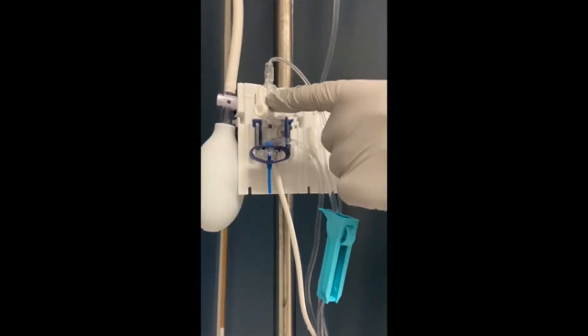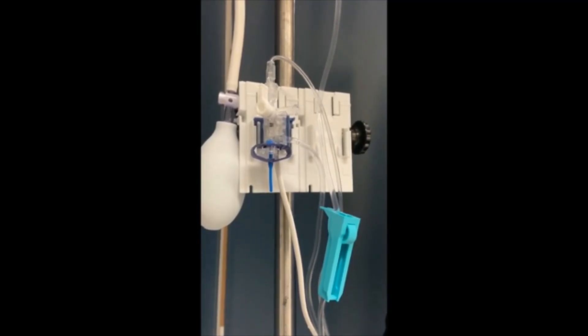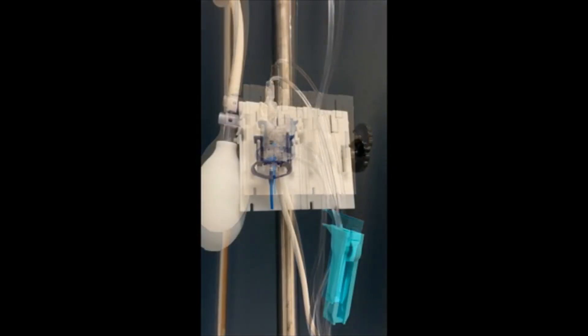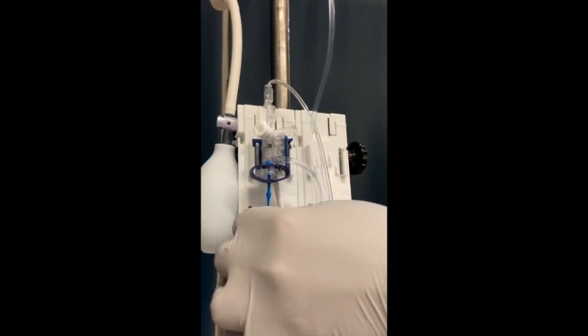Notice that the word 'off' is on the stopcock. IV fluid will not flow in whichever direction the 'off' is pointed. When the stopcock is pointed in an upward position, the IV fluid is off to the patient. Pull on the blue pigtail and allow fluid to flow from the normal saline bag and out of the transducer port.